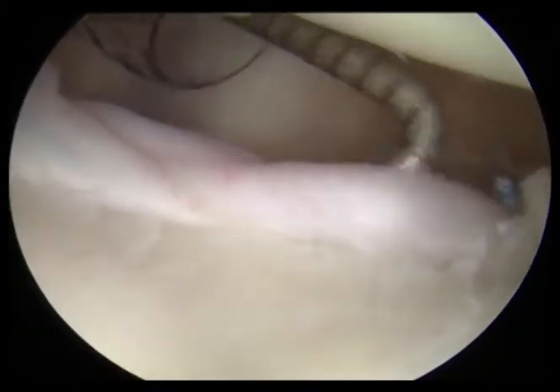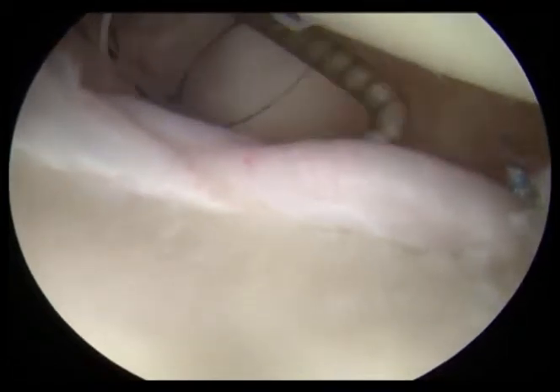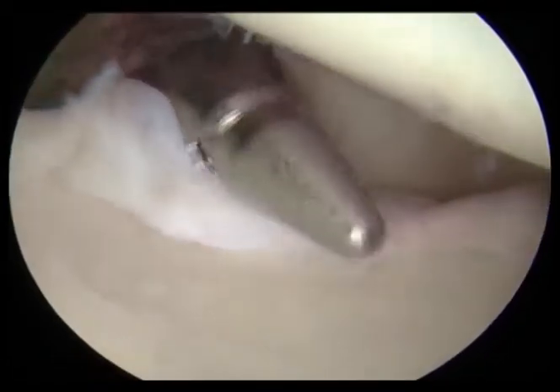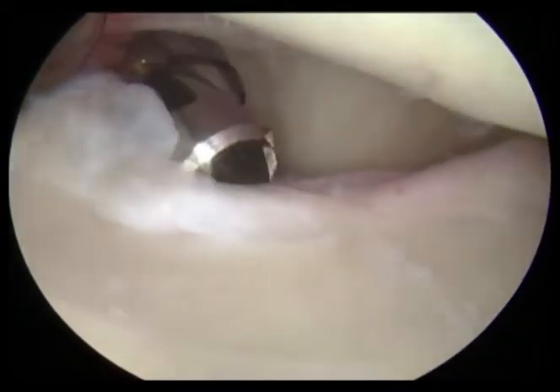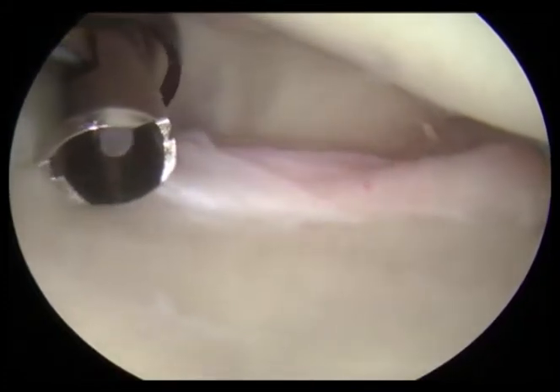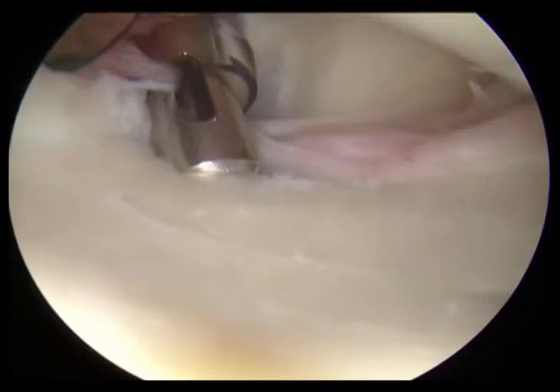The probe demonstrates that we're able to place that labrum back up against the bone securely. Here we are using an instrument to place our anchor into the bone — this is a drill guide that allows us to place a small drill hole into the side of the bone below the joint surface.